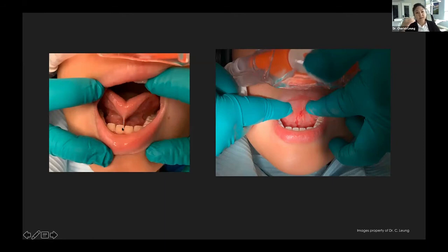When it inserted, the lingual gingiva was blanching, has an anterior and posterior component. So you can see the tongue curling all the way up like that. Can't even lift it halfway. Super strong indicators. Post-procedure, you can see, whoa, we can elevate that tongue all the way up there. It is super flat. You see our little diamond shape there, and awesome release.